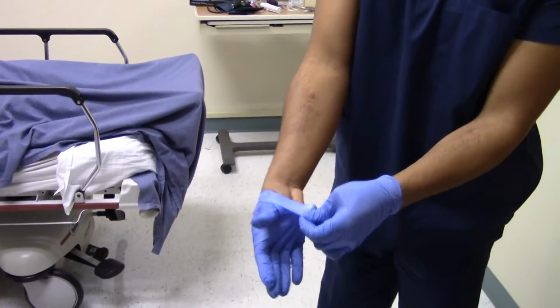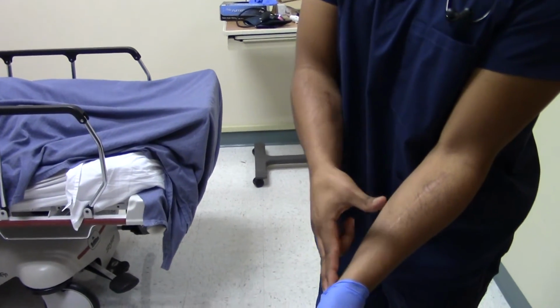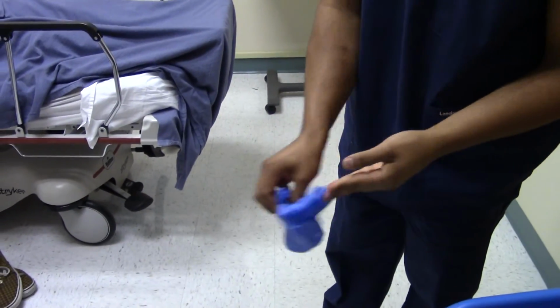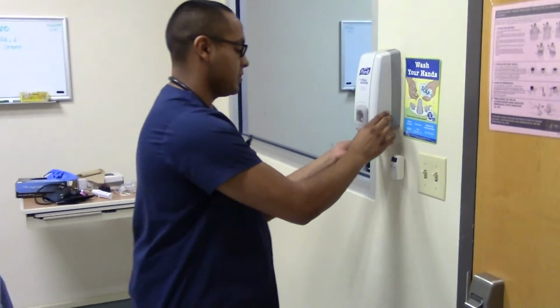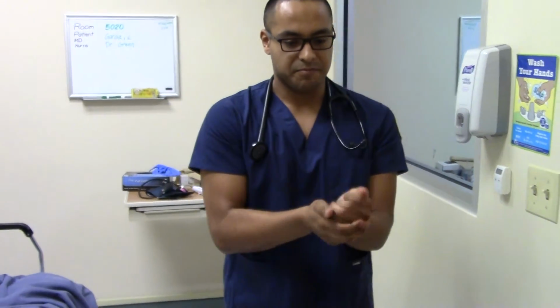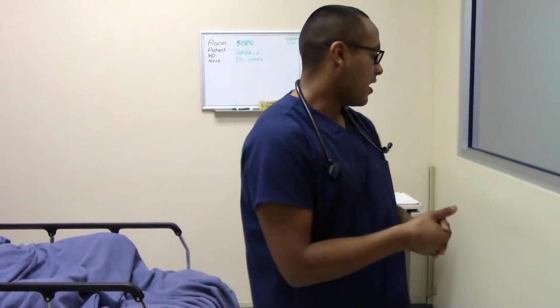Before you leave the room, I'm going to show you glove removal. Pinch here. Boom. Here. And kind of shoot through here. Dispose. Then you would want to hand sanitize. Where's the trash? Here. Hand sanitize your hands. Antiseptic here. Clean your devices. Have alcohol in your pocket, so you can just do it and you don't have to go anywhere and find alcohol wipes. Get some more actually.